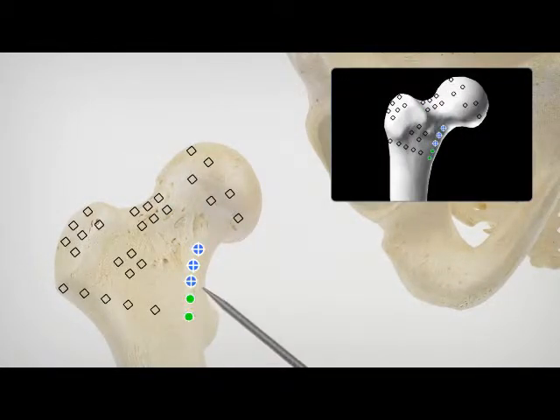During surgery, the patient's unique hip joint is registered and aligned to the preoperative plan.